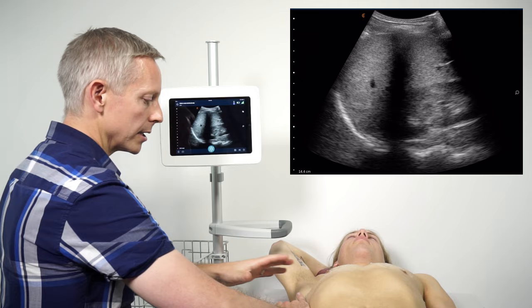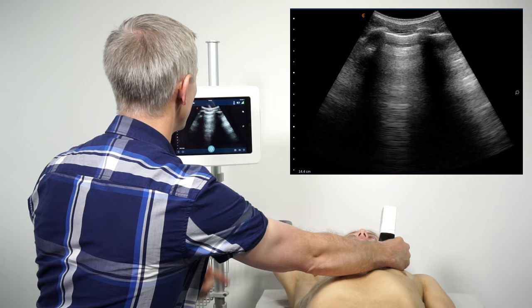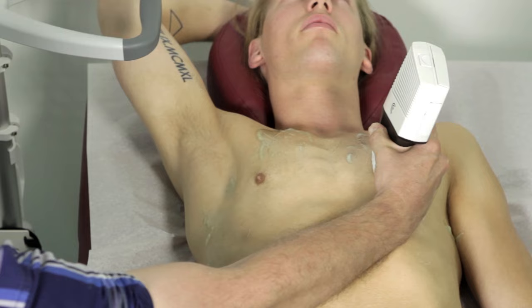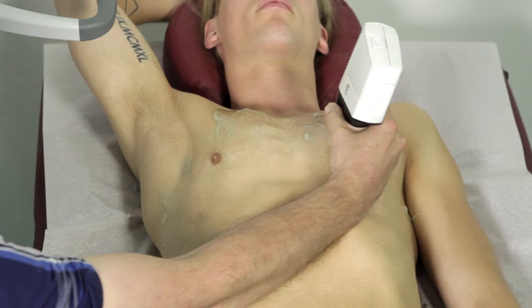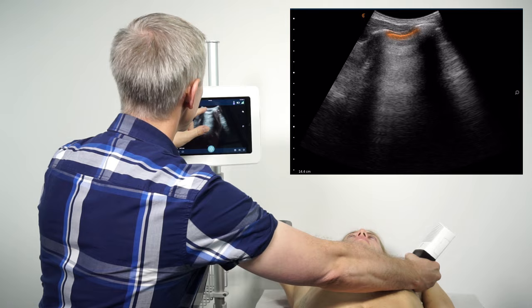I'll move on to the left hemithorax, starting up in the anterior chest. I can see my ribs and the pleural line nice and bright. I'll make sure the transducer is oriented to maximize the angle of insonation of that pleural line. Once I see those A-lines, I'm confident I've got a nice soft tissue-air interface. Starting to come over the heart, I need to slide a little more lateral to find the lung again. With nice pleural sliding and A-lines present, I'm done in that portion of the chest.